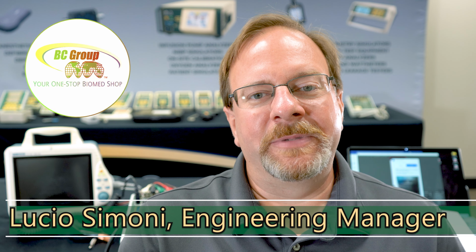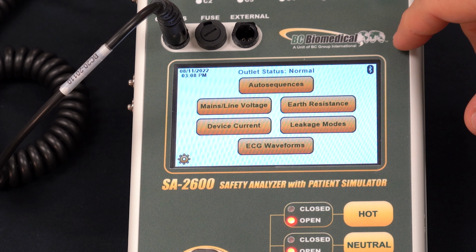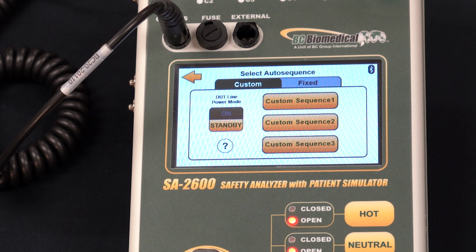In this video, we'll be demonstrating the SA-2600 safety analyzer. We'll show how to select and configure the AutoSequences, and also how to run the AutoSequence and view the test results at the end. To run an AutoSequence on the SA-2600, we press the AutoSequences button from the main menu.